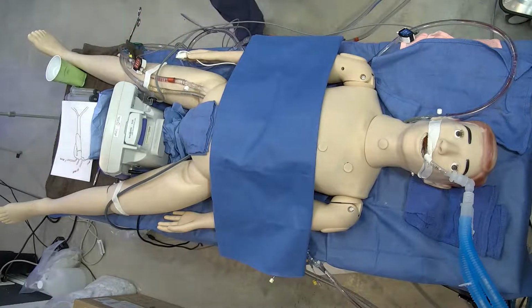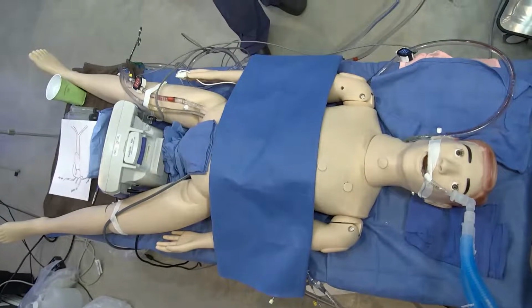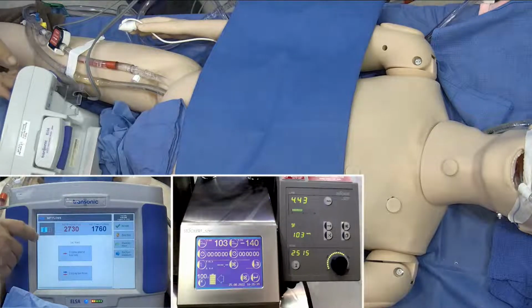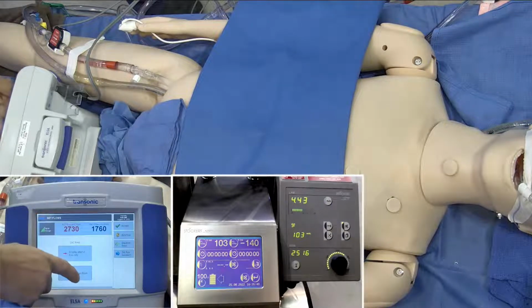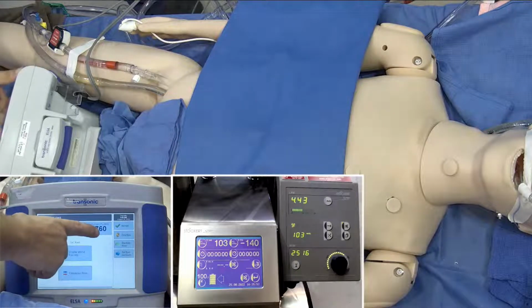Okay, very good. Now, remember that screen we were going to do where you have everything up? So let's go with that. There you go. That is beautiful. Now, what I can tell you is our total flow is 4.43. Our flow going to the femoral artery is 2.73, and our flow going to the venous, to the right IJ, is 1.7 liters.